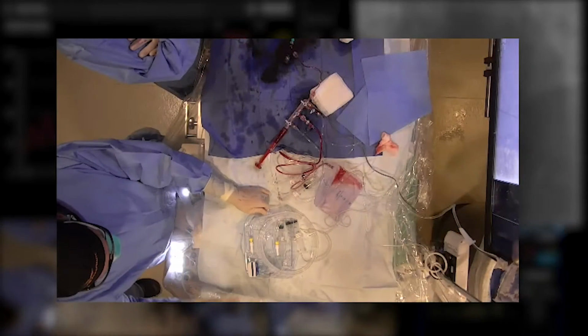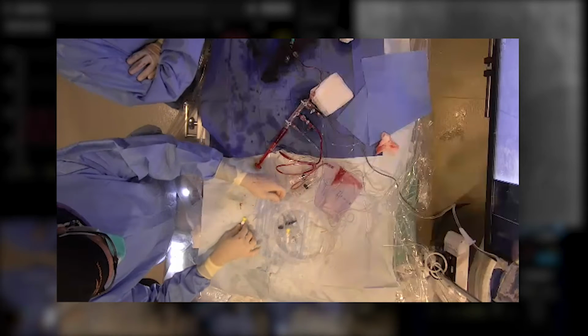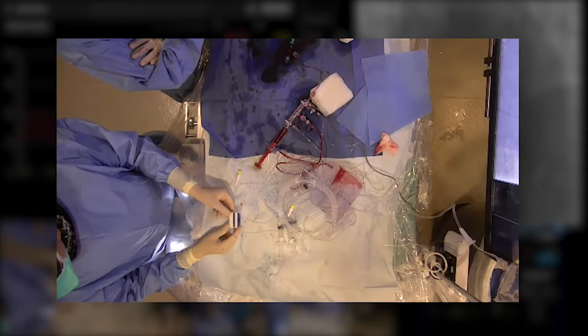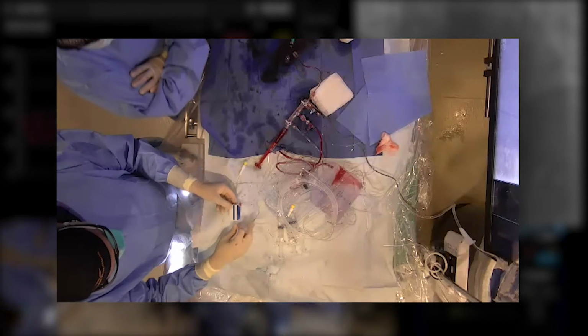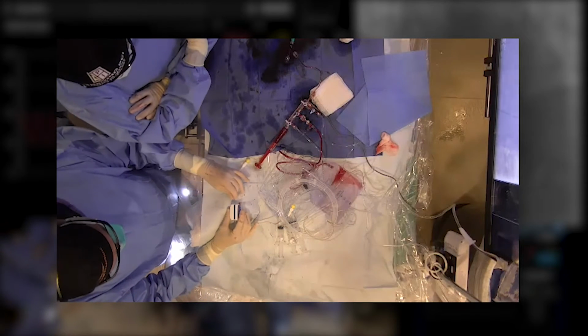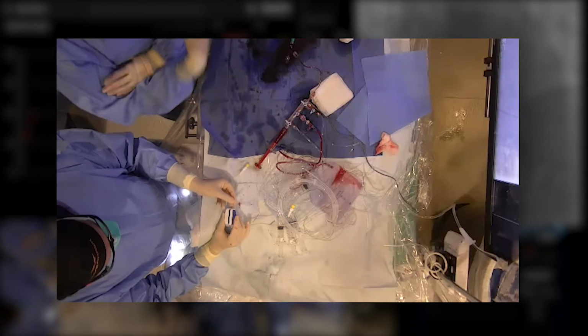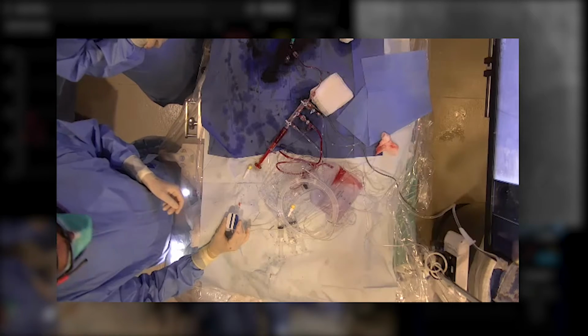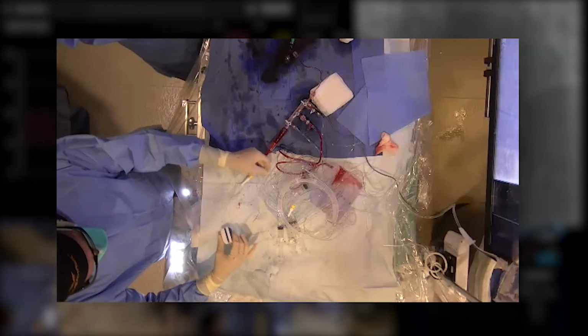And so maybe we can go over this a little bit. So this is a new system here, as you can see. Obviously the torquer is on, but can you see my hands? So this is the way this is now connected, is a little bit easier than in the old one. You basically press this and you can disconnect it, and then when you want to reconnect it, you kind of hook this in. Yeah, and so I was told that if you hook it in at the 45-degree angle, it actually feels like a hook. Yeah, it feels like a hook.